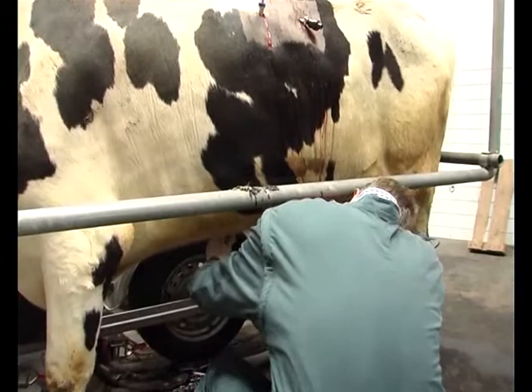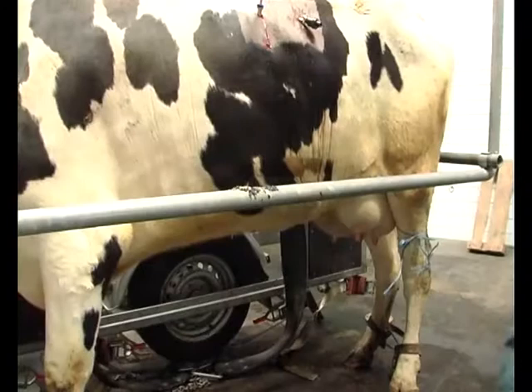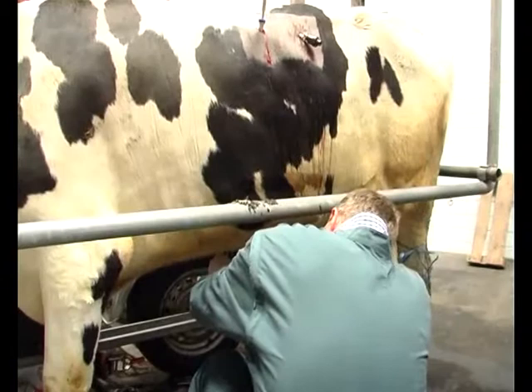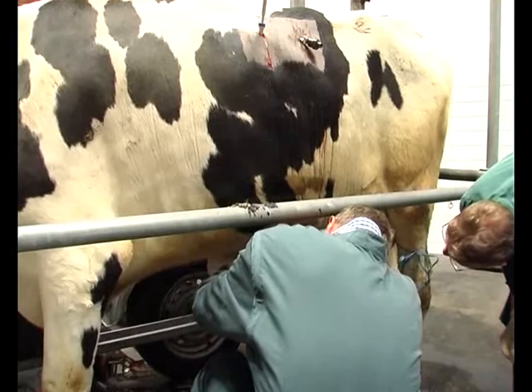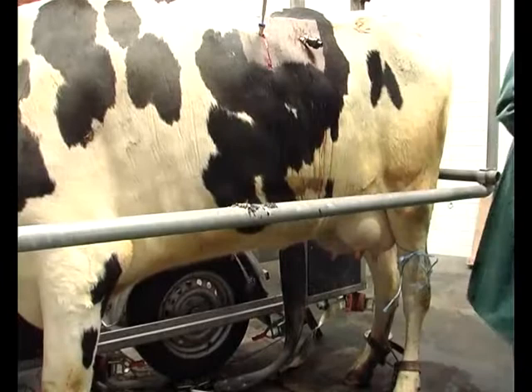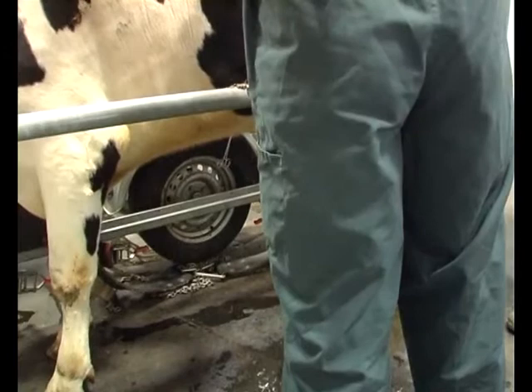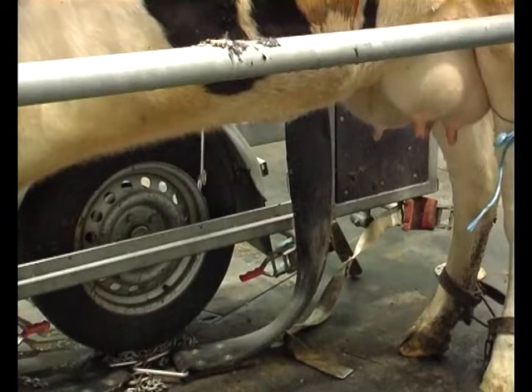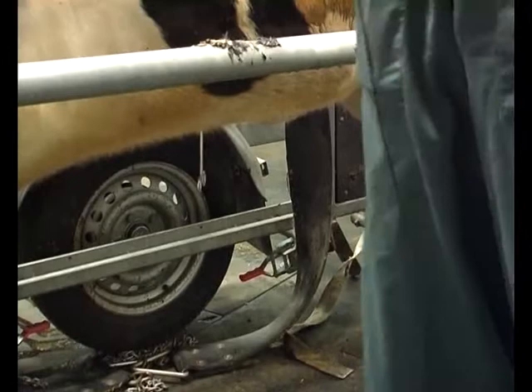Do you have a forceps? Okay, I put on the forceps, go back, draw back the needle, bring it high. Oh, well, I don't know if this means anything, but I like clean fluid. This is all right. Now we go down to the bottom. Here there are two needles, and you go down, you bring in the wire, and then you can fix.